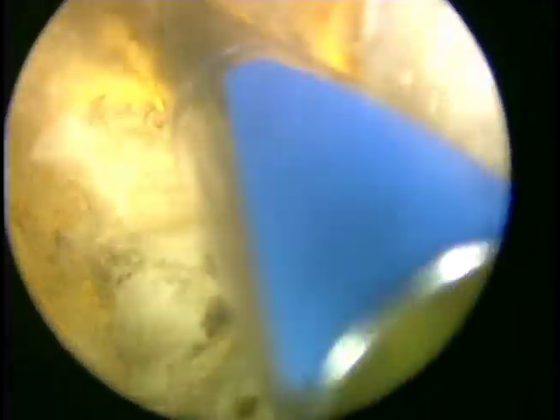Once we've isolated this pedunculated lobe of tissue on the floor, we can bring the power to 180 and spend the time from either of the sulcuses firing horizontally, and thereby always having a direct visual cue of distance away from tissue. The optimal distance is approximately 2 millimeters, which is about the width of our surgical fiber cap.